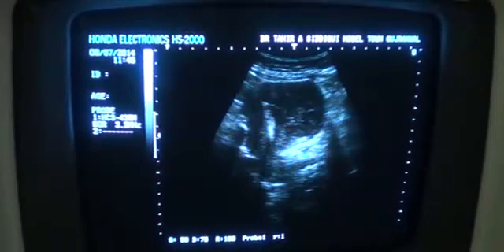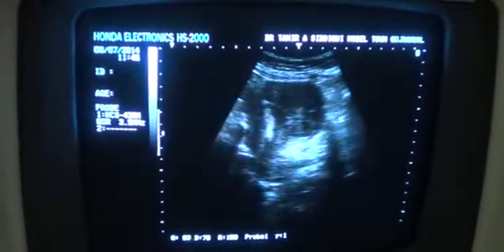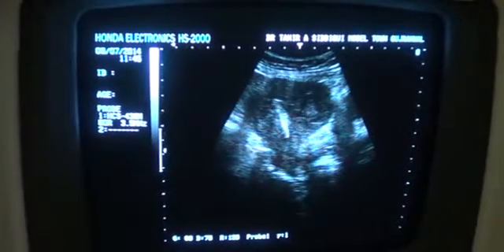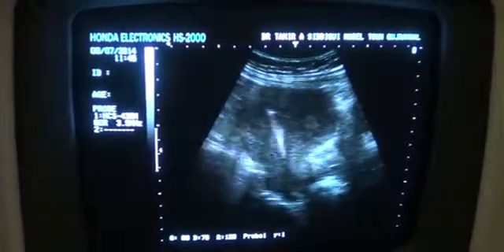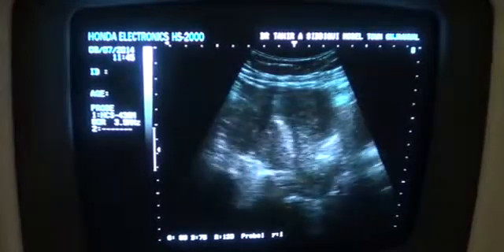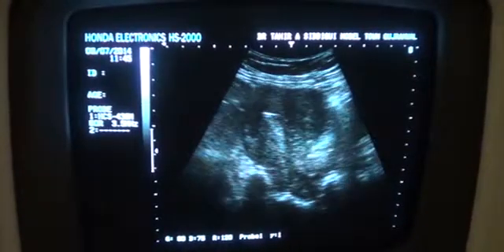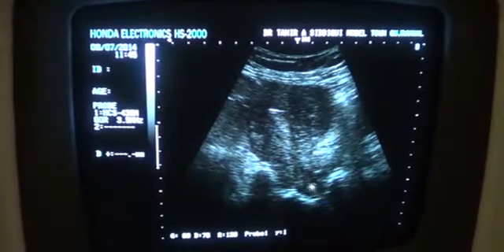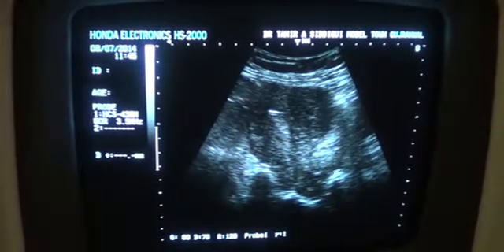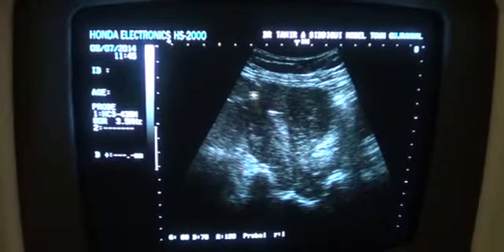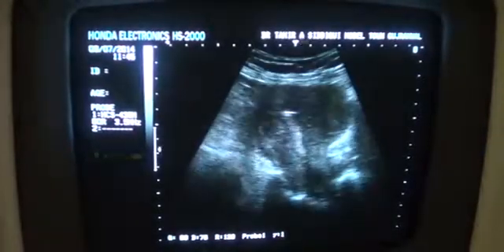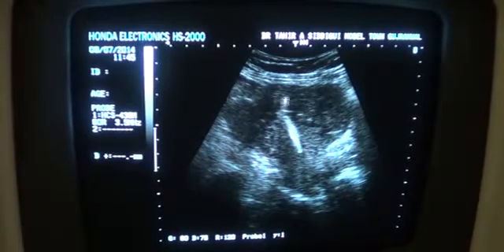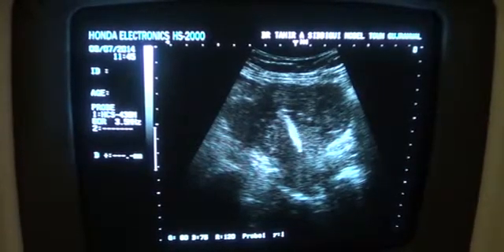In this video segment, you are seeing the uterus with IUCD inserted or placed normally. This is the anterior lip of the cervix, posterior lip of the cervix, cervical canal, and this is the myometrium. This is the IUCD in longitudinal section and the anterior myometrium.